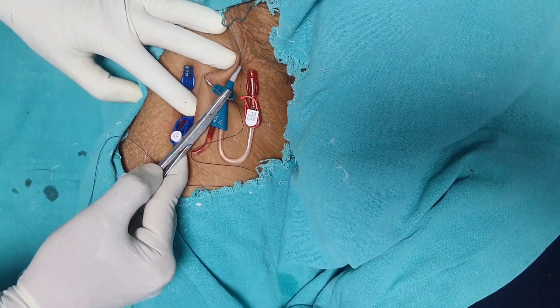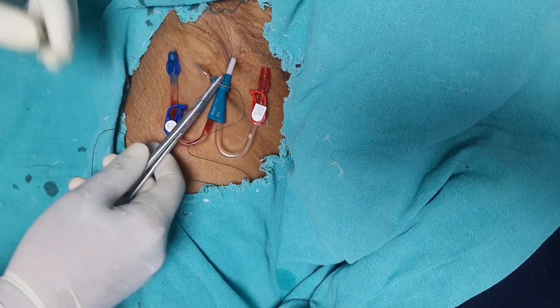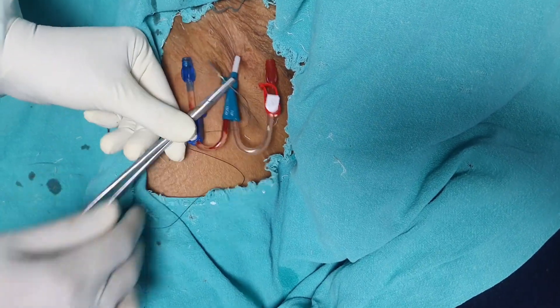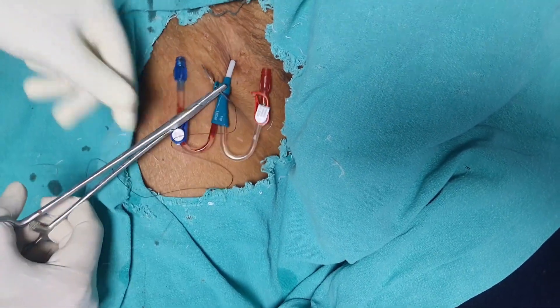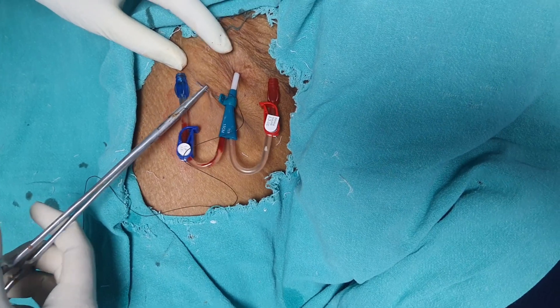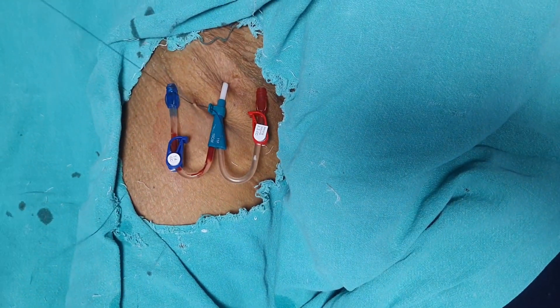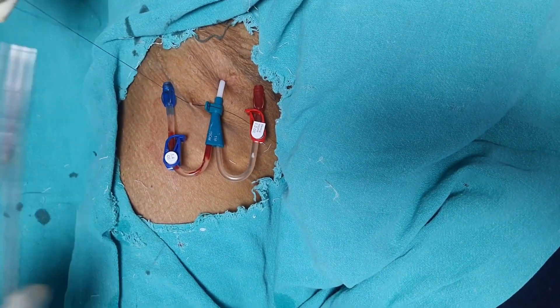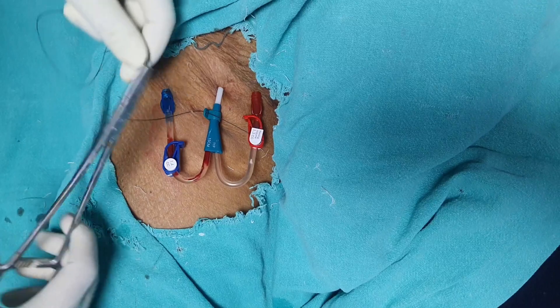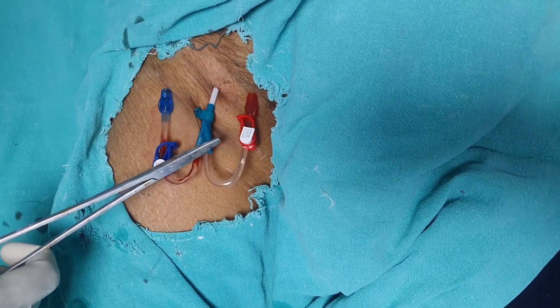Do not drive your needle beyond the inguinal ligament, otherwise it will cause injury to abdominal viscera and peritonitis. So we just have to go 3 to 4 cm inside only, not beyond that.